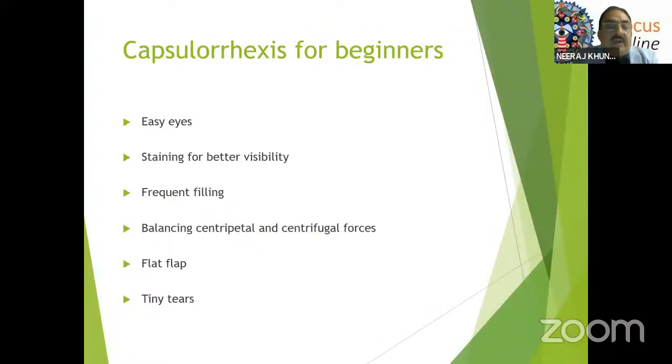So in brief, the beginner should select easy eyes, staining for better visibility, frequent filling, balancing the centripetal and centrifugal forces. They should keep the flap flat and make tiny tears as shown in the video.